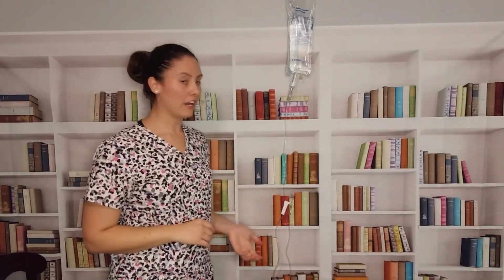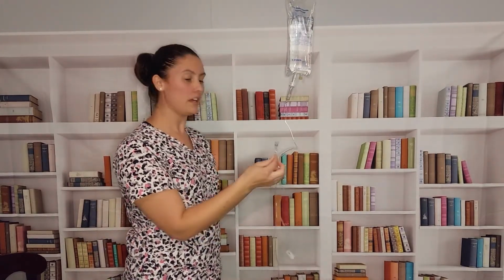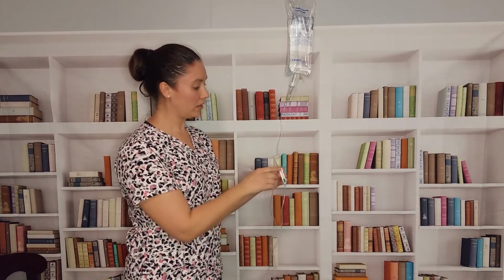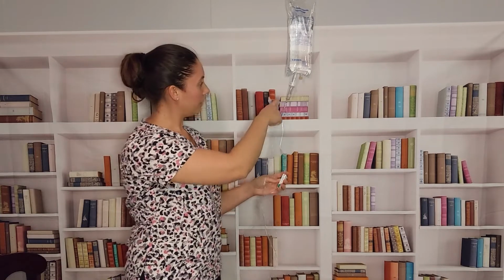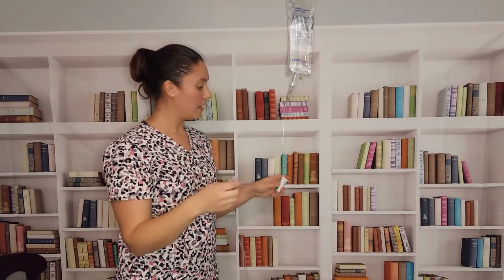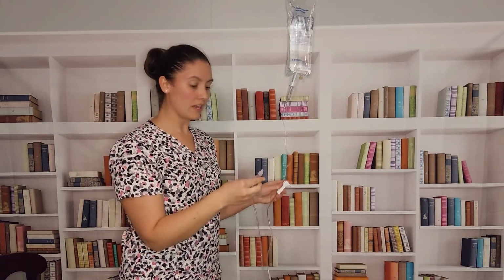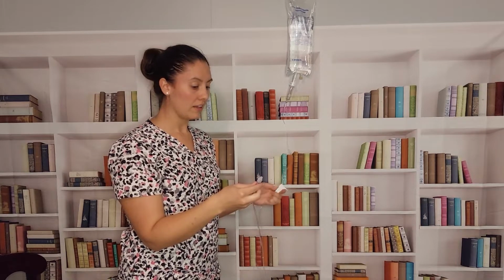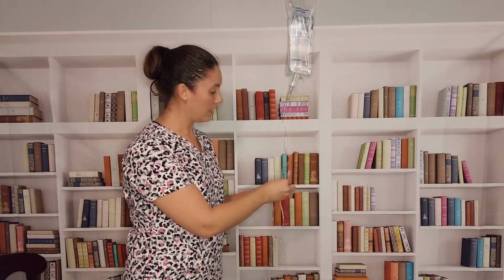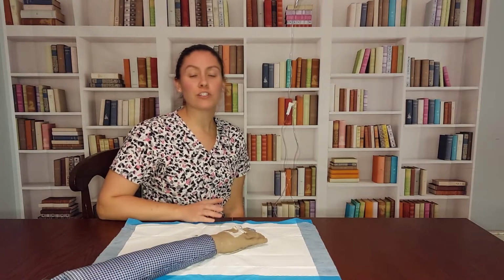Now that we have our IV hanging, we want to make sure that we get all the air out of the line. So what we'll do is bring this all the way up. We'll let the fluid run through the line until it hits the end, and then we'll stop it once again. It just takes a second, and we stop it once it starts dripping, and we can hang it back up here.